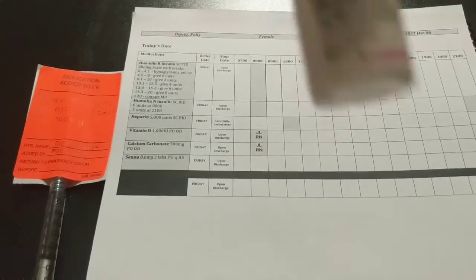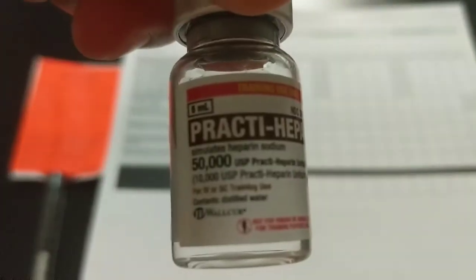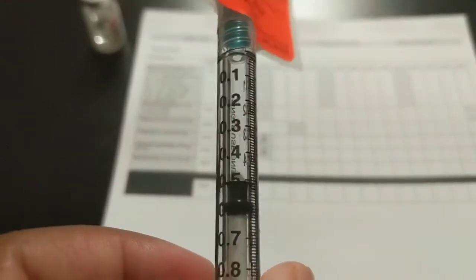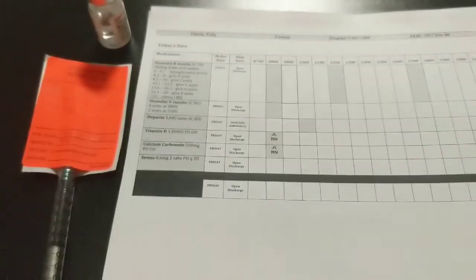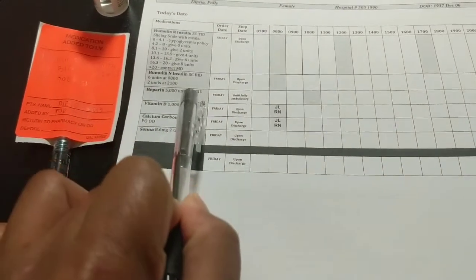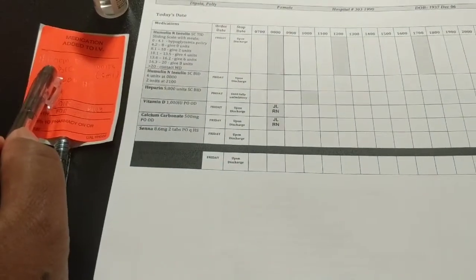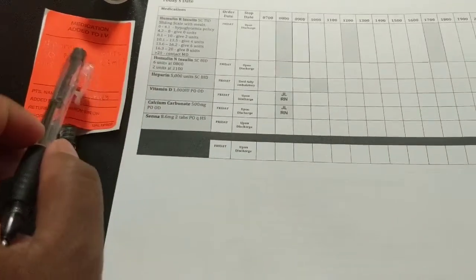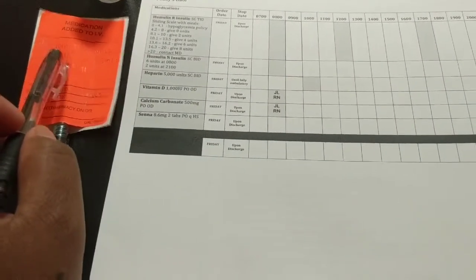When you look at the medication, the concentration is 10,000 units per ml. So we aspirated 0.5 ml according to the computation. Next is the route, which is subcutaneous, and next is the time, which is BID, or twice a day.